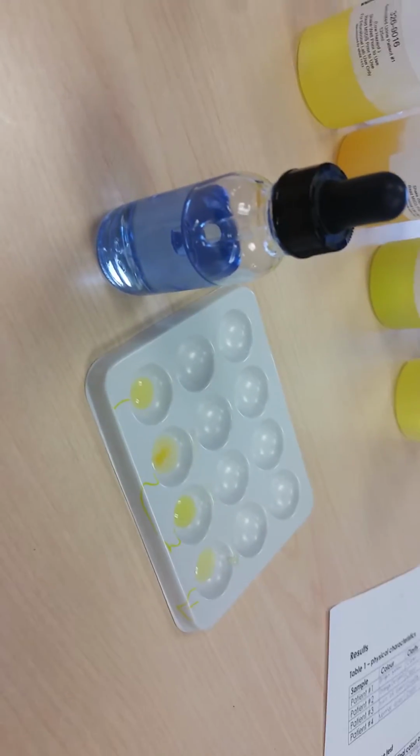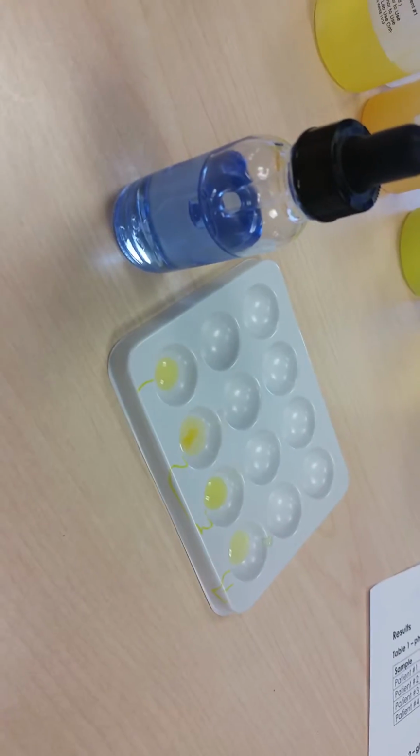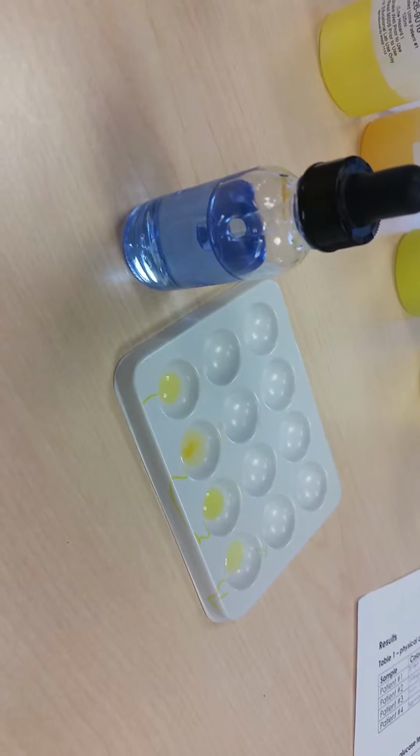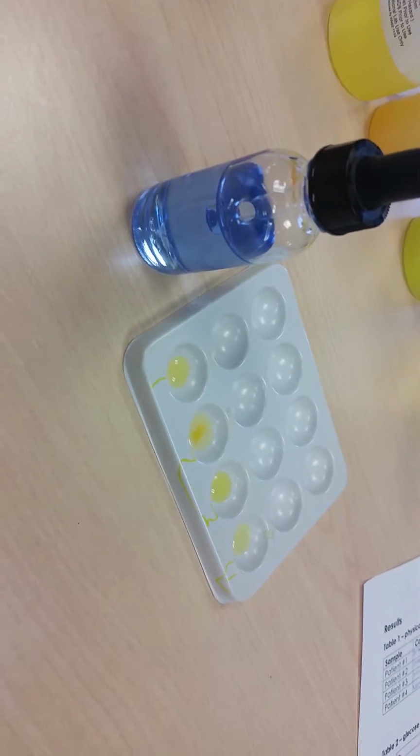Now because it normally turns a purpley color, but we're mixing it with this yellow urine, you're probably going to get a color change to a greenish color, which is just the two colors mixing together. So what we're looking for is if it turns a reddish color, because that purpley color mixed with the yellow is going to be sort of reddish.